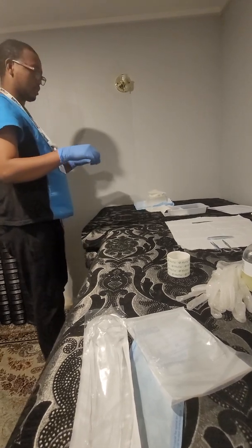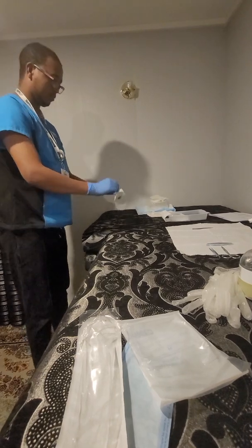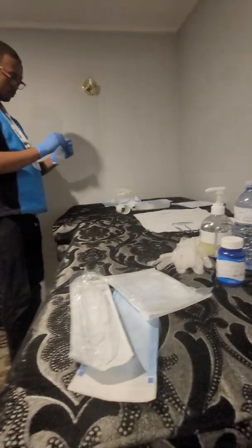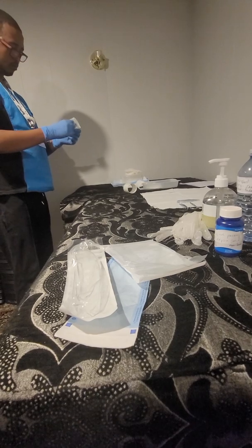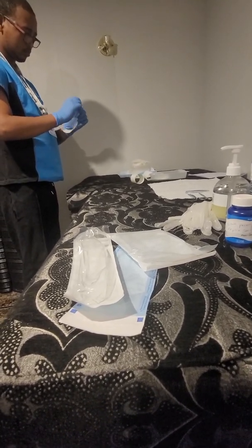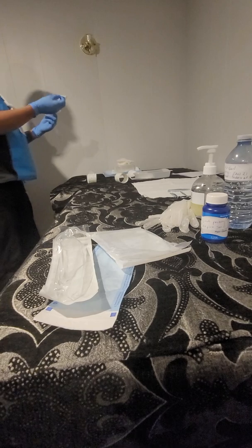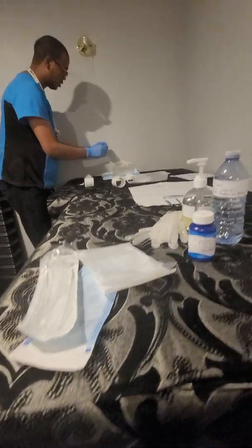Now I don't have to be sterile anymore, but I'm gonna tape it. Tape it with 1 inch.